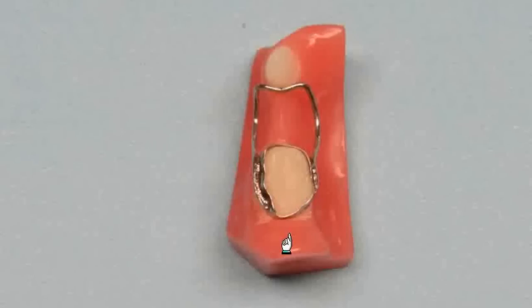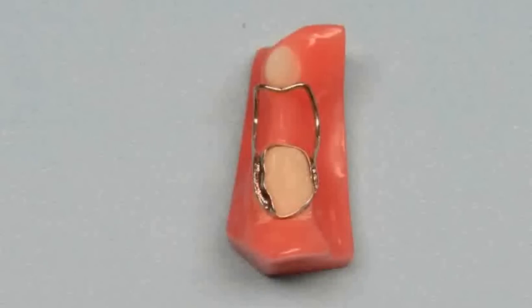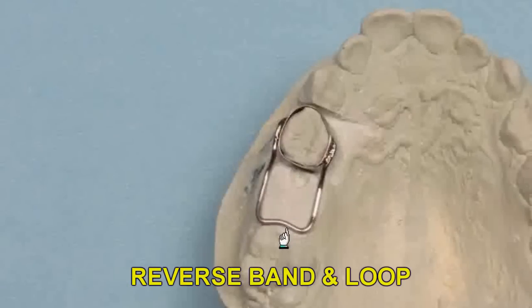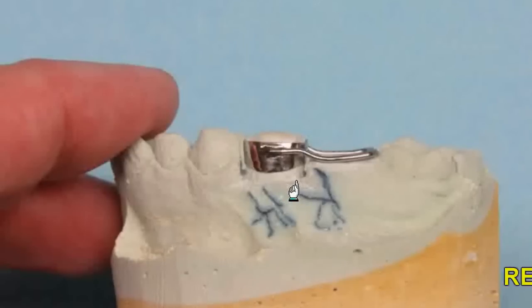For years the standard appliance for unilateral space loss has been the band and loop. This appliance consists of a band on a molar and a wire loop that engages the distal of the tooth you're trying to hold. The wire will hold the space so neither of the teeth can move. Usually this appliance has a wire facing mesial. In very young patients where the first molar has not erupted enough to band, you can place the band on the first deciduous molar and run the wire distally to the mesial of the permanent first molar. For this design, you want to make sure there is good root structure on the first deciduous molar, as the space maintainer will be lost once the tooth is lost. The band and loop is ideal for unilateral space maintenance.